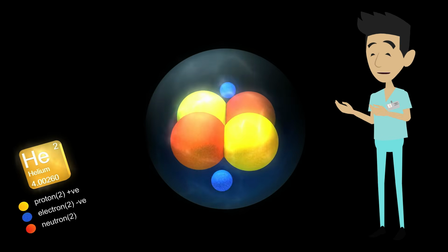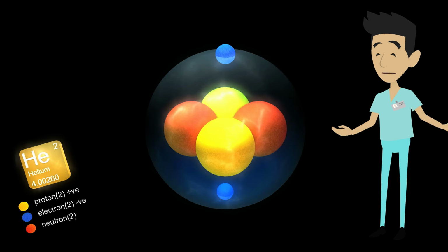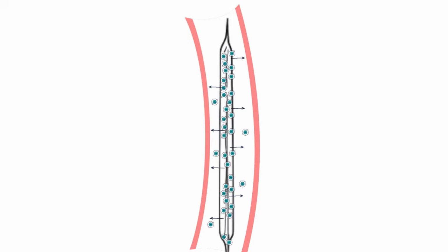Helium is used because it is a very small, low-density gas, which allows it to move quickly and support rapid therapy delivery. This is an illustration of an intact IAB catheter in the descending aorta. Helium is a small gas molecule, so it can move across an intact balloon membrane. This normal and expected process occurs even when the balloon membrane is fully intact and does not result in harm.